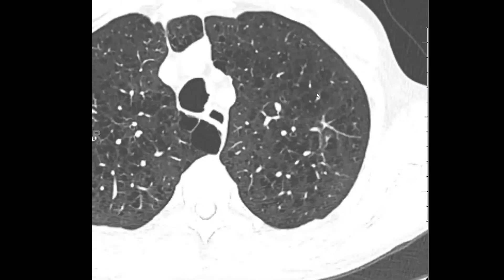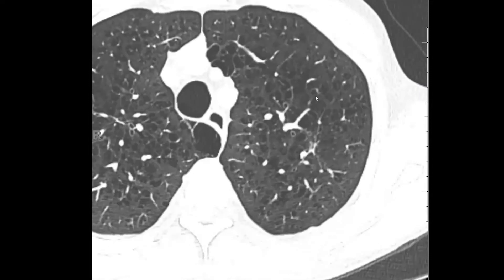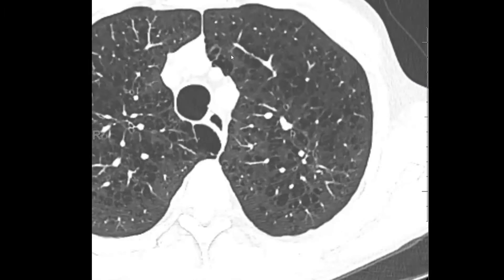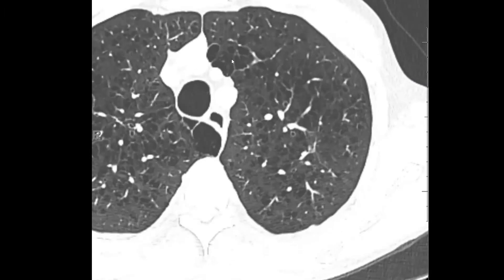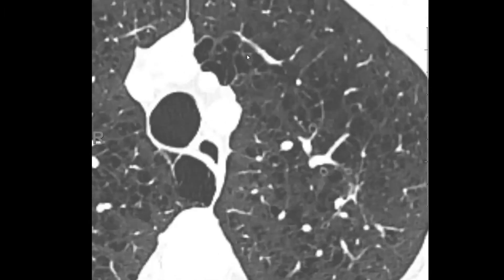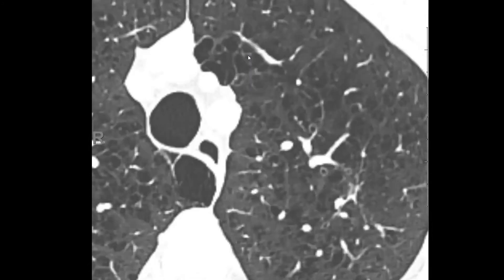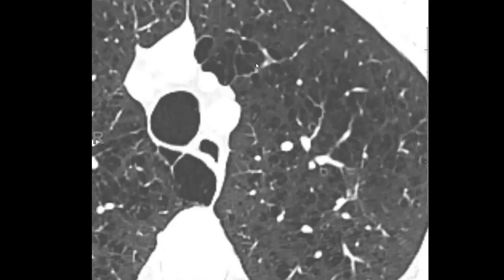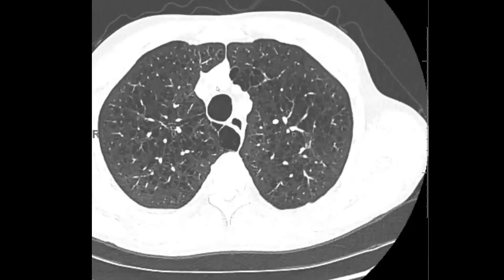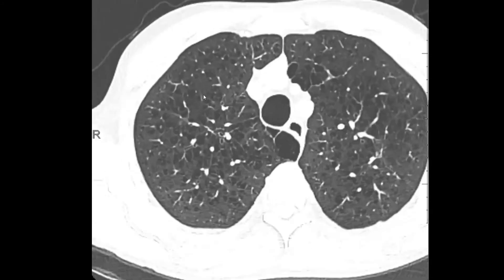These are examples of centrilobular emphysema. When the centrilobular emphysema coalesces, you start to see areas of confluent emphysema — for example, in the left upper lobe, where multiple lobules are diffusely involved with emphysema. Sometimes you get a little bit of dilation as well.